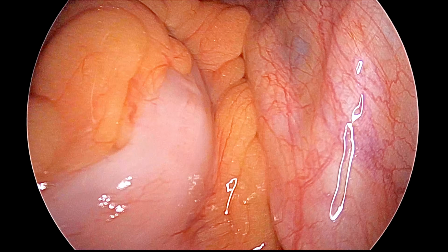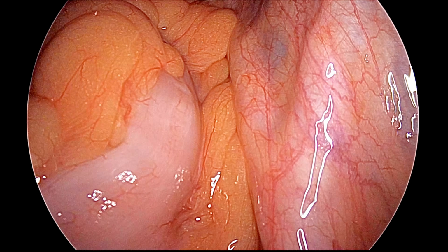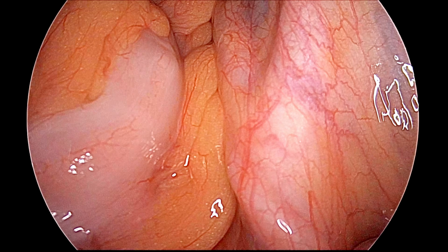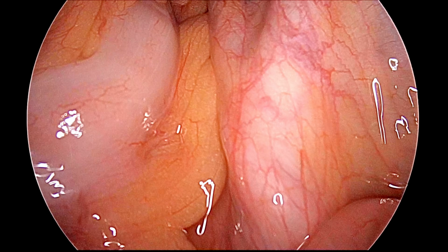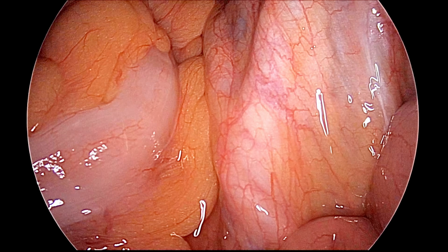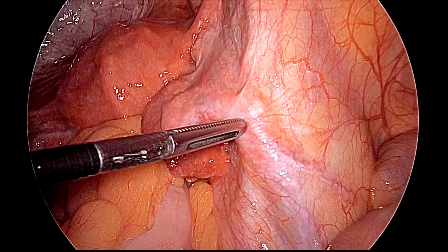This is also called the triangle of doom, because in this area you have to be very careful that you should not injure any structure, otherwise major bleeding can happen. And ureteric peristalsis is also visible below. So this is the right side, and after that we will see the triangle of doom.